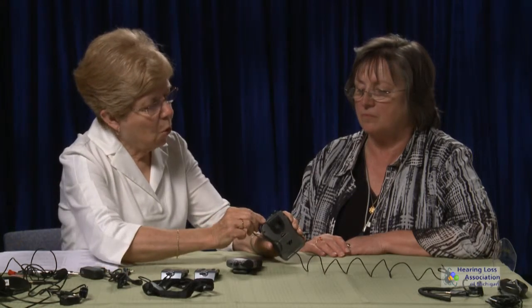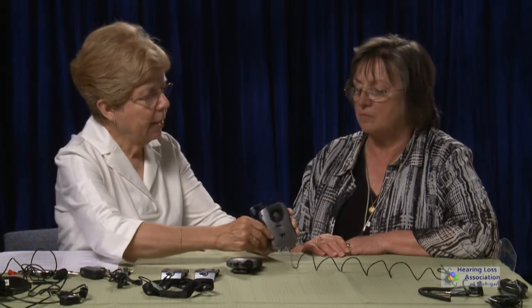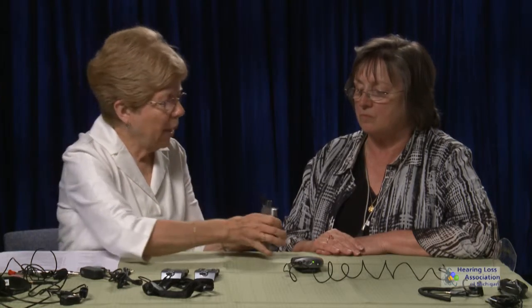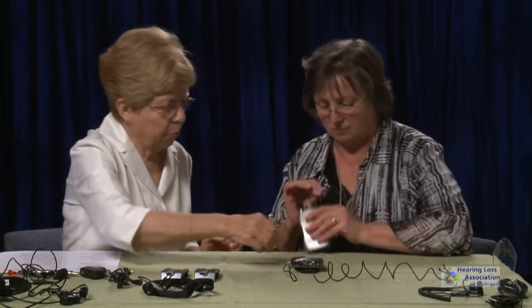All right, so this works with alkaline batteries again. And both systems are going to give you at least probably about 100 hours. Generally I feel like I get even more time than that. You're going to use the same coupling devices, the same options, and you can make a selection. And you already have the neck loop on. So why don't you go ahead and plug the neck loop into the plug with the headset icon.